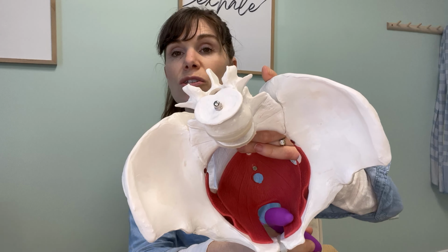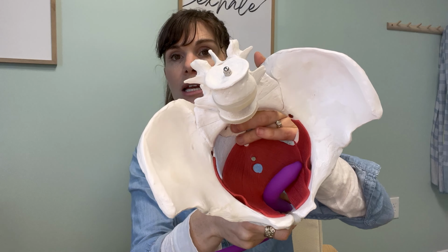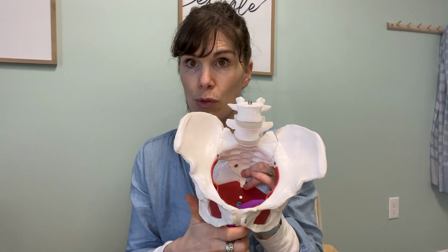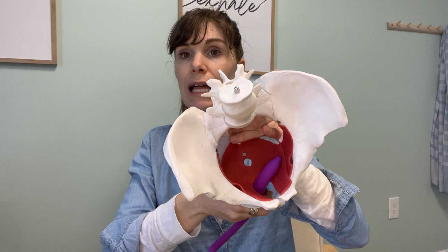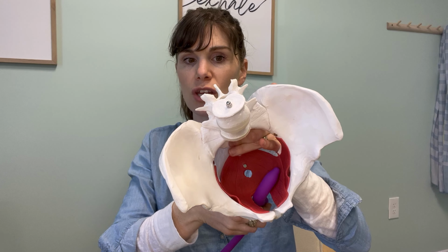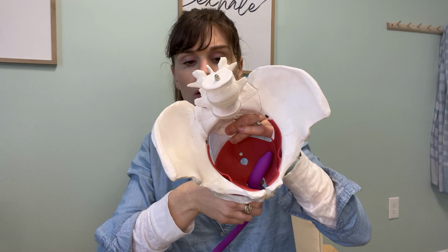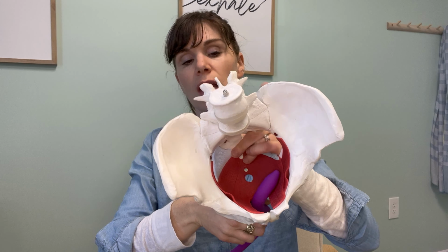So once you've done that, then you're going to pause. Say it was uncomfortable here, you're going to pause and you are going to breathe, and you are going to think, on my inhale, I want to lengthen where the dilator is. I'm going to lengthen on inhale, letting go of tension, creating space where the dilator is, looking for the sensation of melting underneath the dilator.